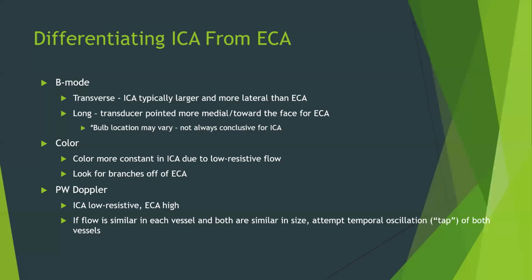So the bulb location, the bulb is not always as prominent on some people, and it may be a little bit different. So it's not always conclusive for the ICA, but it can help you if you're looking at that as well. Color Doppler.